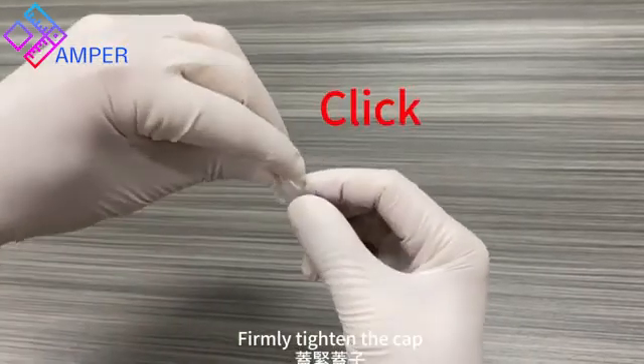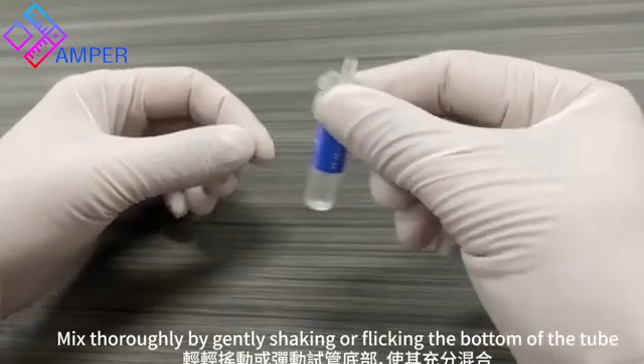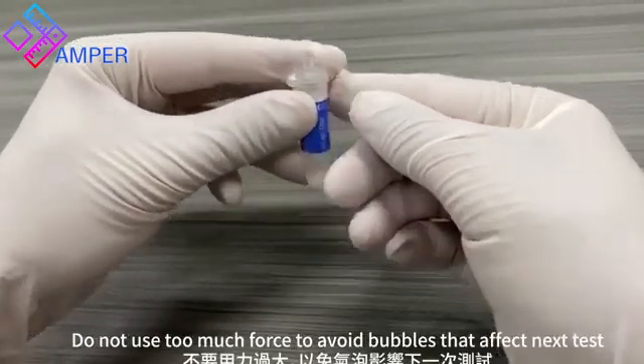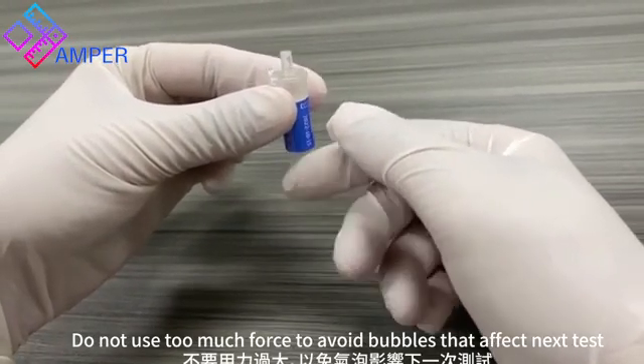Firmly tighten the cap. Mix thoroughly by gently shaking or flicking the bottom of the tube. Do not use too much force to avoid bubbles that affect the next test.